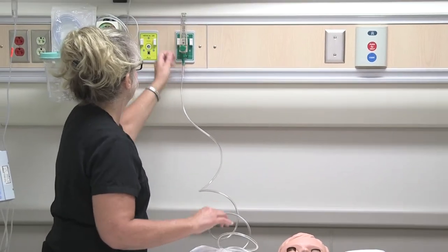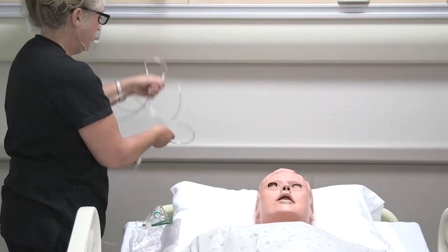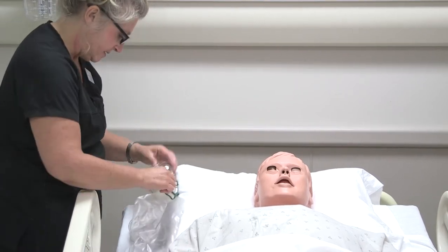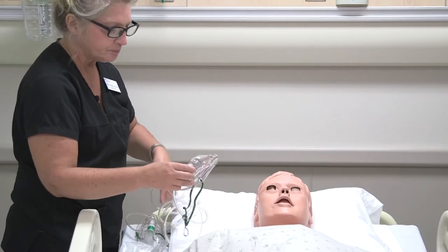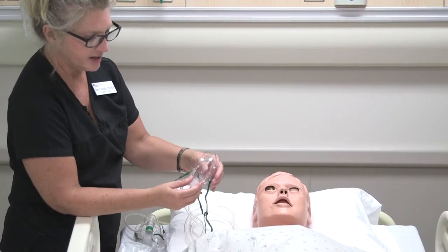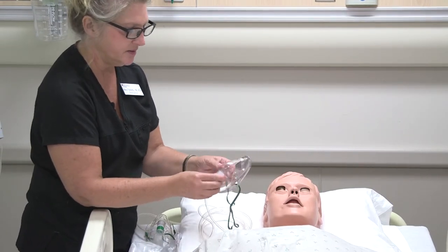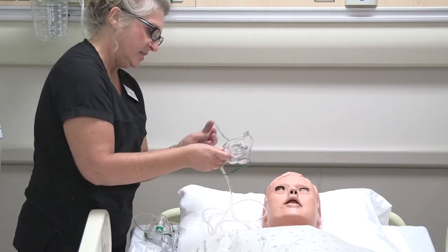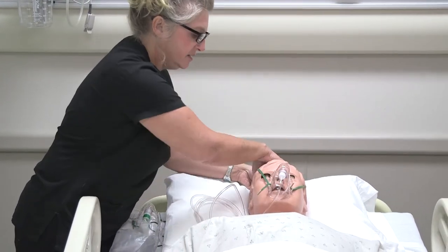We're going to take this one off and show you the simple mask. The simple mask can be used for flow levels of six to ten. It's just a simple mask which allows air exchange — your oxygen and the carbon dioxide that the patient is blowing out. You can see that there are vents on the side. This goes right over the patient's head and on the bridge of the nose.